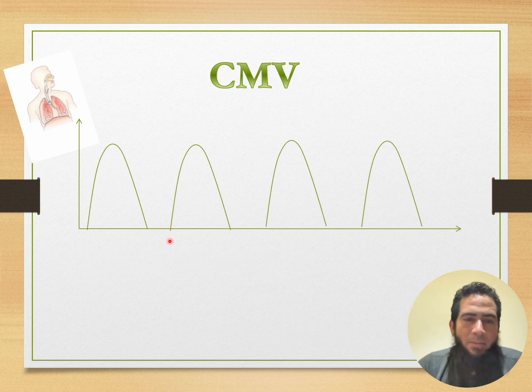Each certain time, for example, 20 breaths per minute is just every 3 seconds, it's given a mandatory volume or mandatory pressure. There is no interaction or negative triggers at all between the patient and the machine. That's controlled mandatory ventilation, and it's almost not available in any machine at the moment. It's just historical, but it's important to understand the IMV and SIMV.